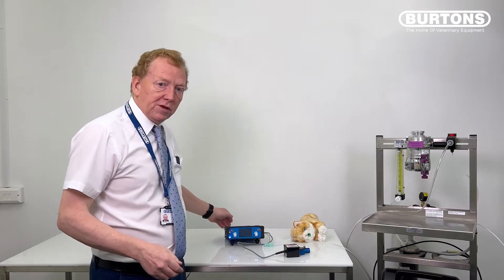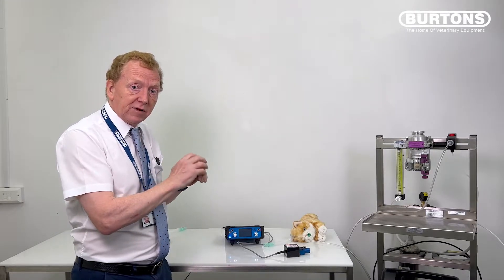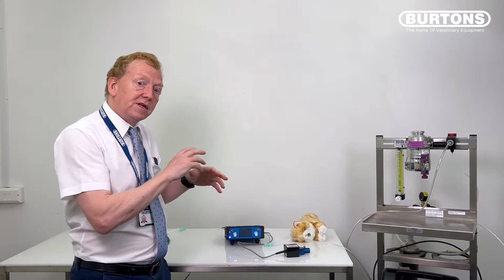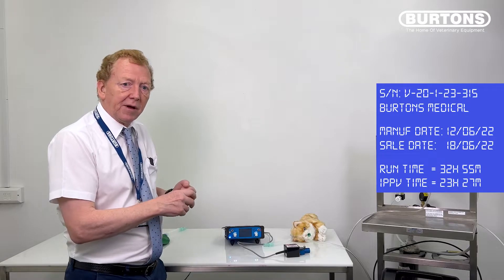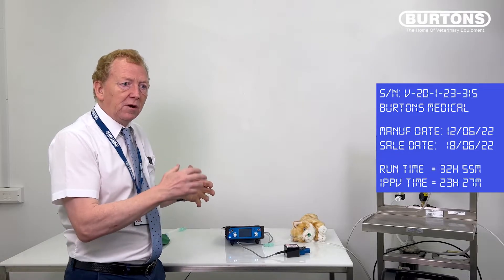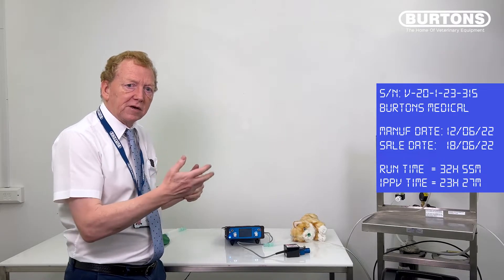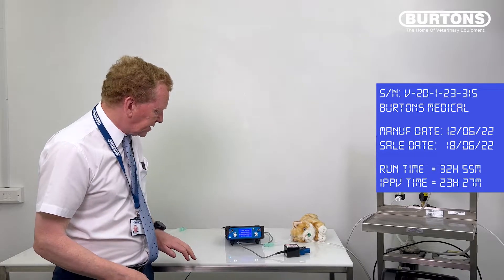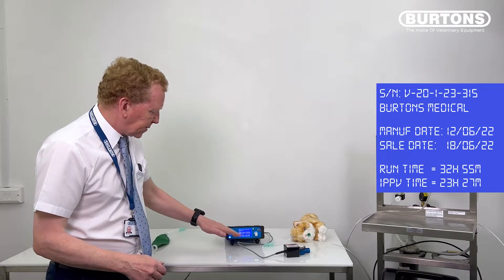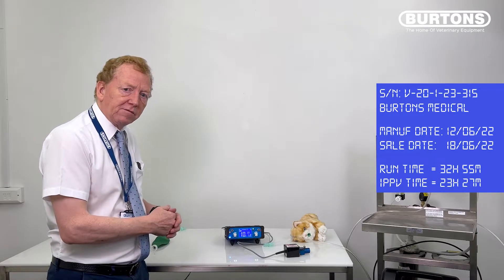The first thing is turning the unit on. You'll get a splash screen — it says 'Produced in the UK' and gives you a serial number. Then it goes to a second screen — pay attention to the runtime hours. At the bottom you'll see RT for runtime and the IPPV time. If your IPPV time is getting up to around 500 hours, you're looking towards a service; certainly by 1,000 hours you should have had a service.